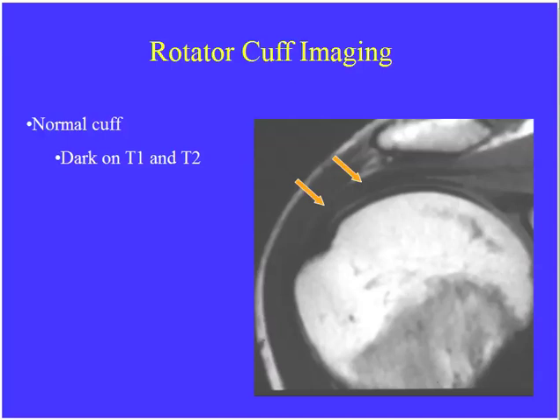The rotator cuff musculotendinous junction lives at the 12 o'clock position of the humeral head. This is a T1-weighted image — we know because we have bright signal fat and subcutaneous high signal fat with no fluid in the joint. The cuff should be dark on both T1 and T2 — it's made of fibrous material. As the cuff comes across, you shouldn't see any intermediate or high signal within it all the way down to bone. Follow this black line all the way to the bone and make sure it touches without any high signal.